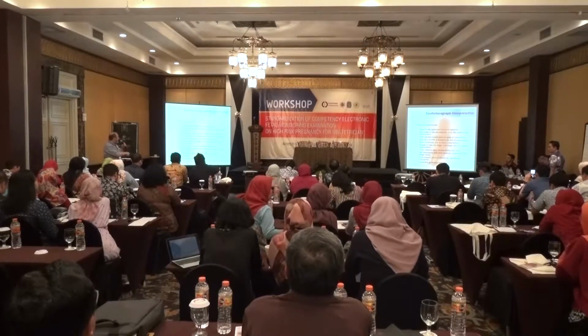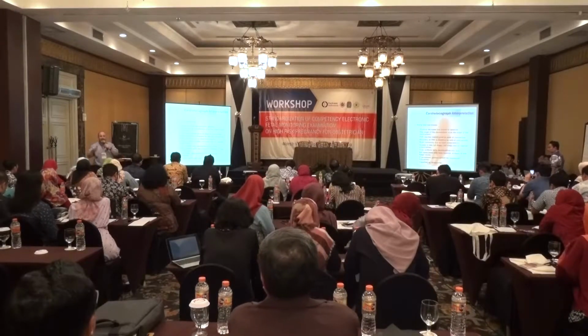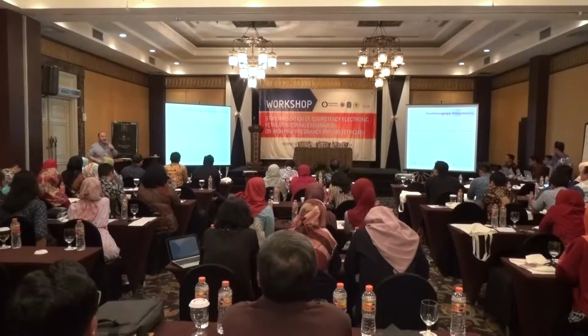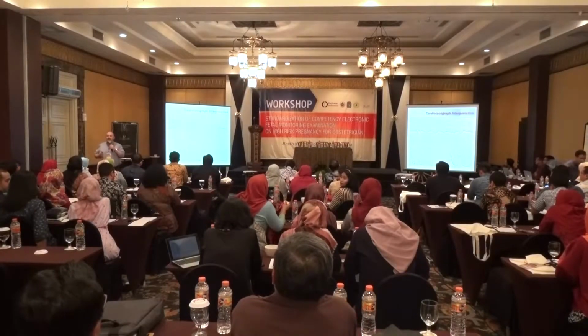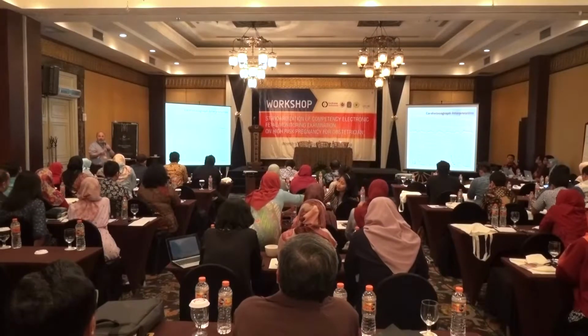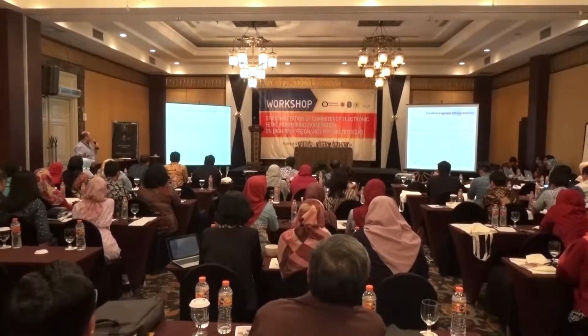So I'm going to pass by these because I've said a lot of what's on the slides. But I want to show you this. This is an early deceleration pattern. Given what I've shown earlier on, do you all agree with that? Just take a moment to look at it. It doesn't matter that it's got a V in the bottom. It's a gradual onset and gradual recovery. Does that make sense? That's the key.